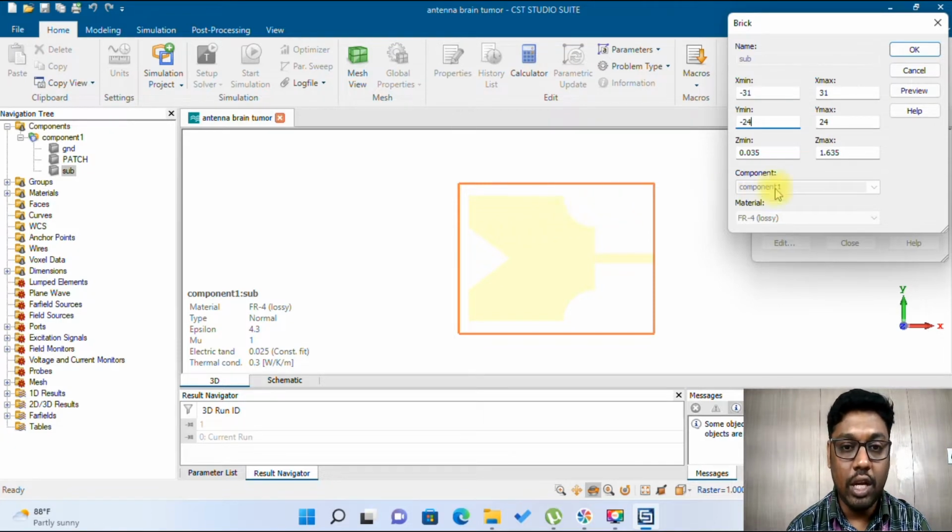In this project I have chosen the substrate material as FR4, a flame retardant material, which has a permittivity value of 4.3, and the thickness of this substrate is around 1.6 mm.